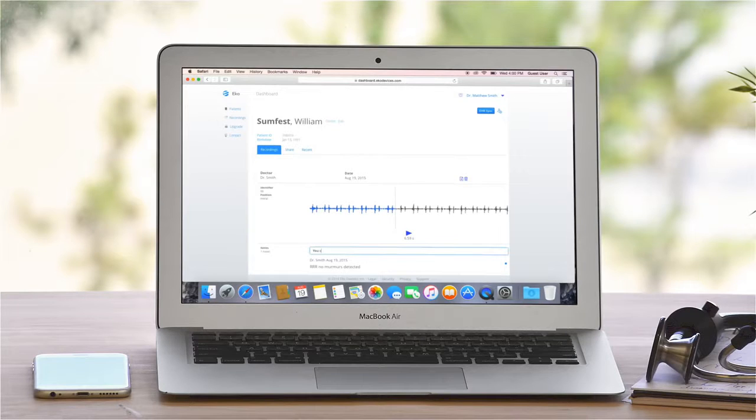Simply select the patient and press play located under the recordings tab. You, or other physician collaborators, can further add notes which will be documented in the auscultation report shown here.